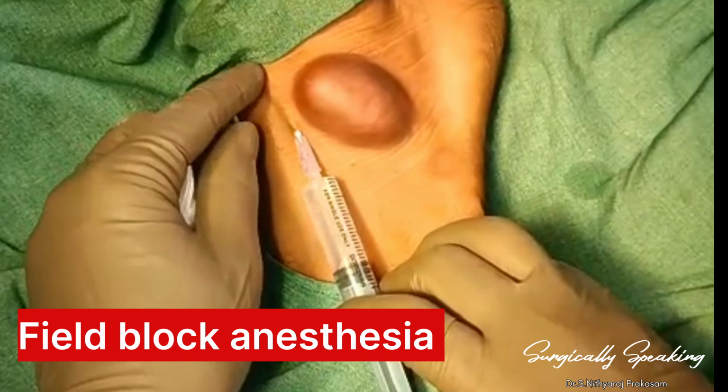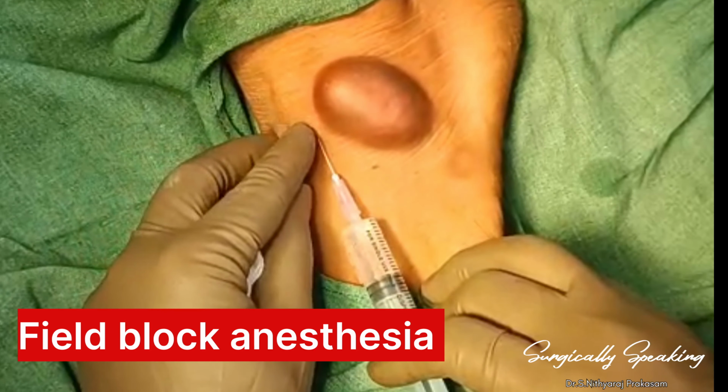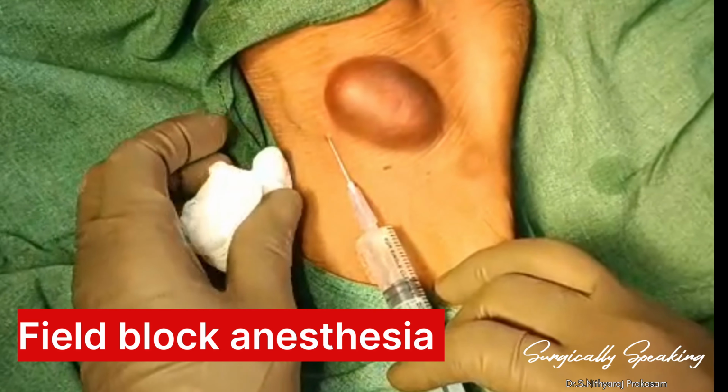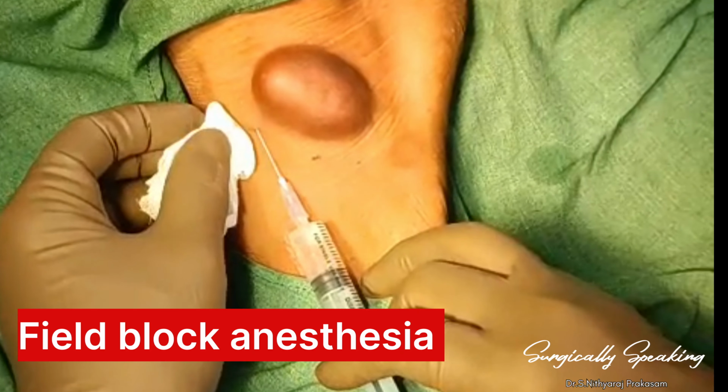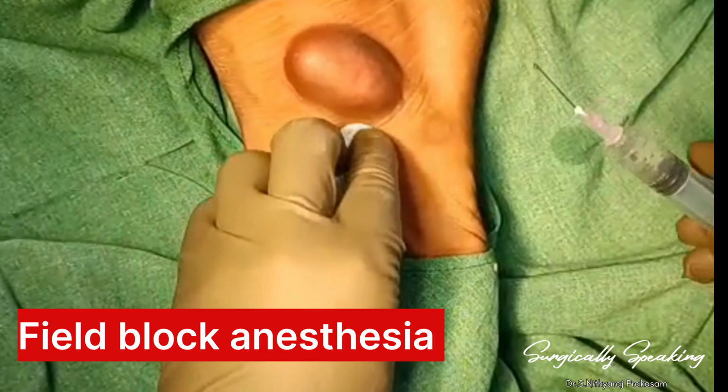I am going to raise a subcutaneous wheal all around. What I have taken is 2% xylocaine with adrenaline. So we raise a wheal all around.